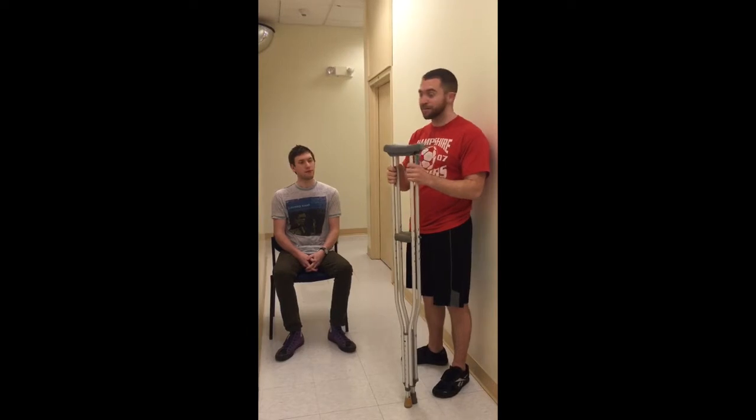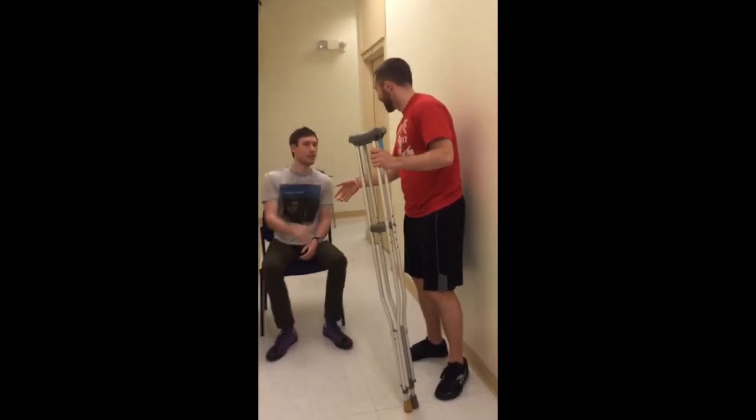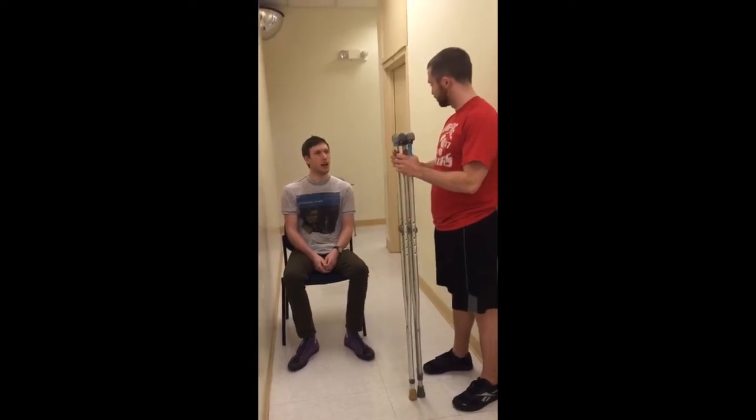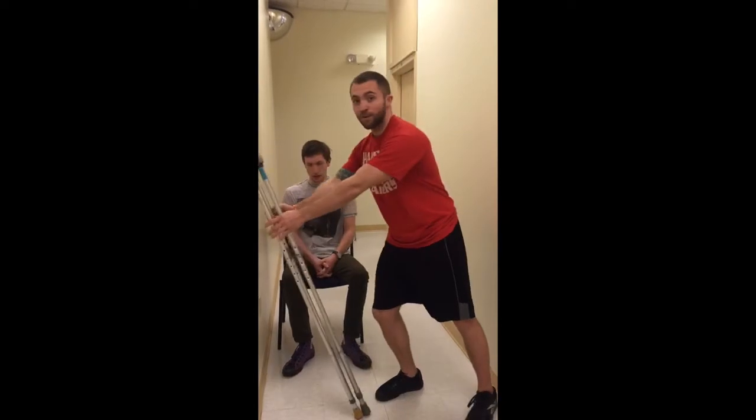you introduce yourself, everything. Hi Will, my name's Tim. I'm going to be working with you today. I'm a PT. Love it. Awesome. Okay, do you know how tall you are? 5'11". Perfect. On a good day in the morning. I like it. Okay, so 5'11".